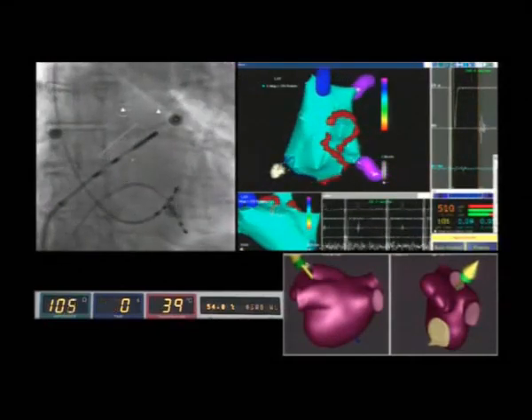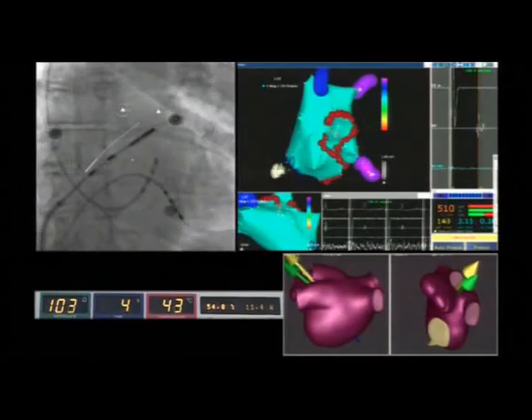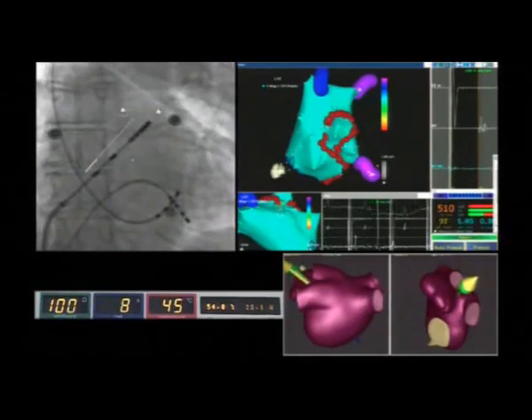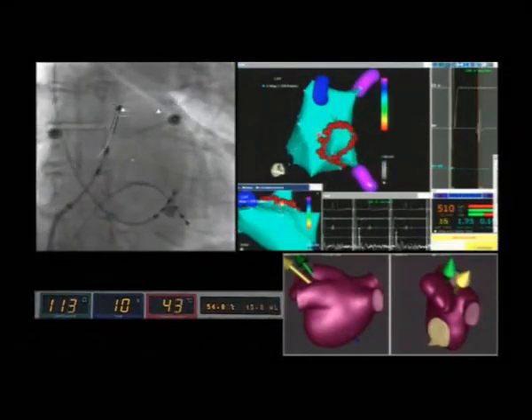On the bottom left panel, you can see impedance monitored in the green box, temperature of the tip of the catheter in the red box, and the time.